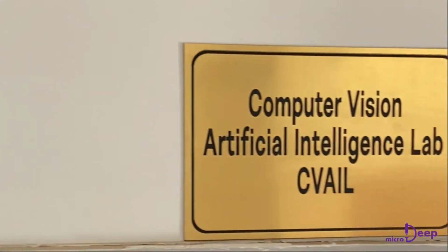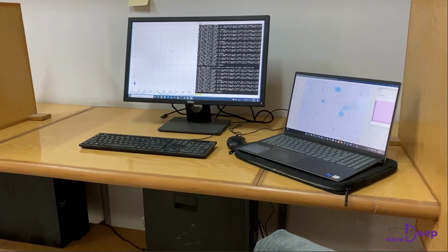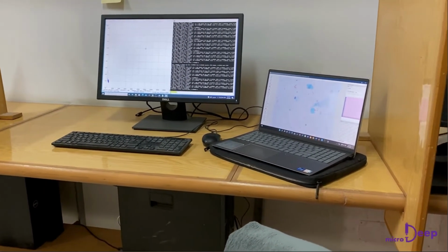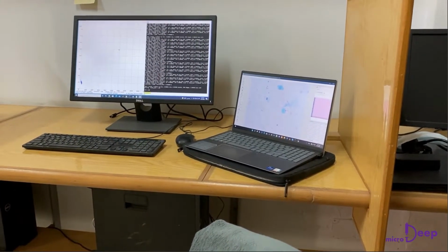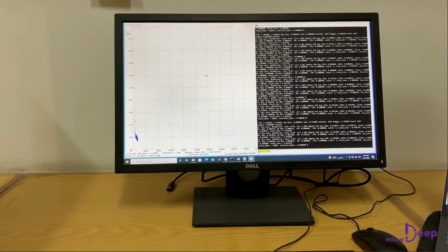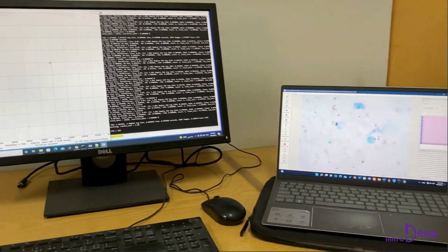Based on the dataset, we have built a deep learning AI model, which was trained on the mentioned dataset. The model takes a magnified, colored photo of the sample as an input and provides a percentage for the possibility of infection as an output. Thus, the model will be able to predict the infection automatically.